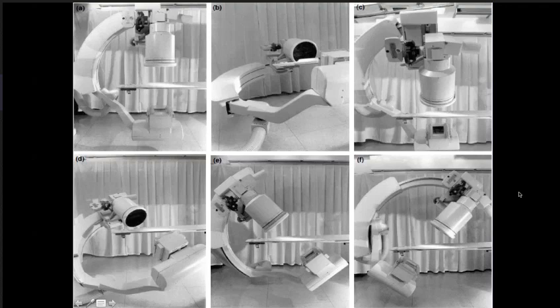Now, it's important to know how an angiogram looks in all these views because you never know in a given patient what view will profile a particular part of the coronary artery or a particular part of the heart. So you have to know the cardiac anatomy in every single projection in space, in 360 degrees. I can turn the heart in any direction, and if I show you the heart, you must be able to identify on an angiogram what chambers lie where. And that is the purpose of my talk today.